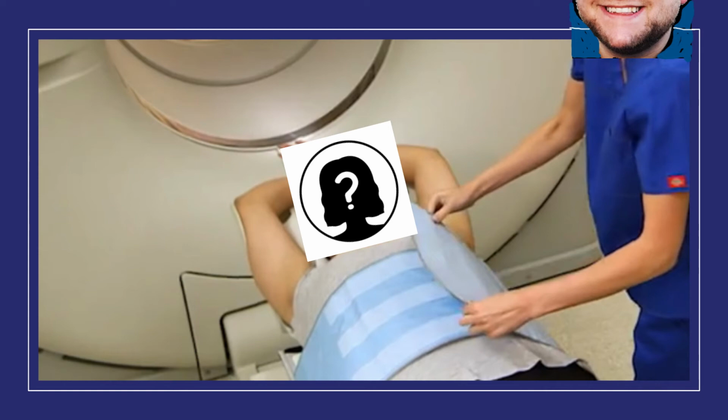After an hour, I escorted my patient to the designated PET bathroom so she can empty her bladder. I made sure to verify that she didn't have any metal in the area of interest. No large earrings, no bras with wires, no face mask with thick wires. I told the patient that the scan will take around 20 minutes and that she will go in and out of the PET CT tube 3 times. The first 2 times will be faster, which is the CT portion of the exam. The third time will be much slower, which is the PET portion.